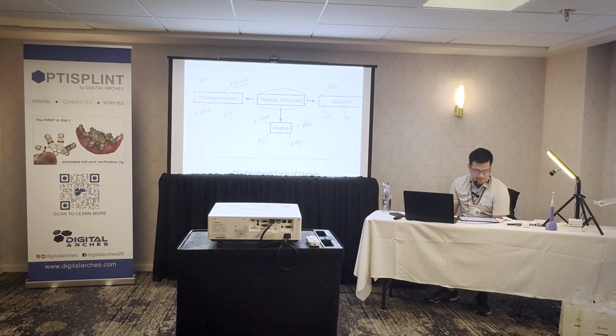In terms of actual scanning, once you get set up, how long is the actual photogrammetry scan? Can you give me a number? If I'm counting putting on the scan bodies, let's say 4 implants per scan. I didn't really use photogrammetry, I did digital scanning. Similar.